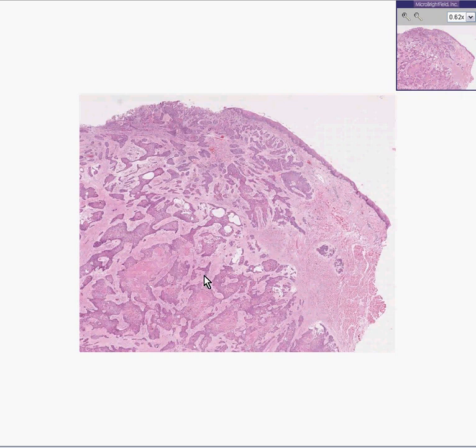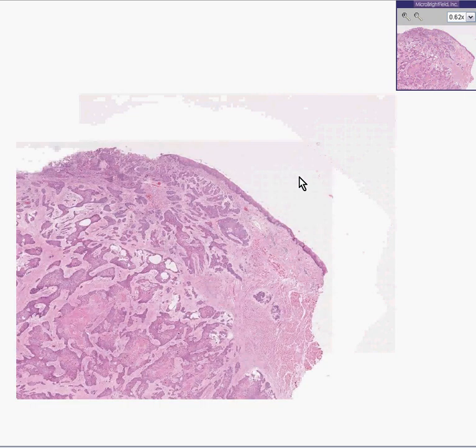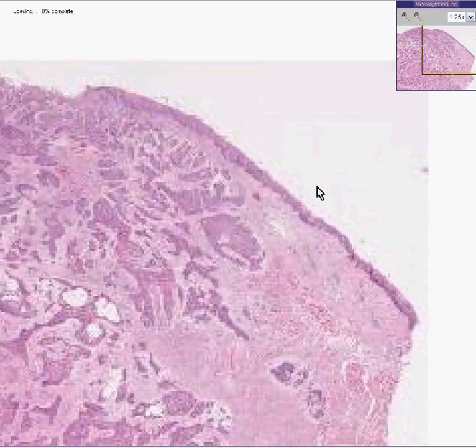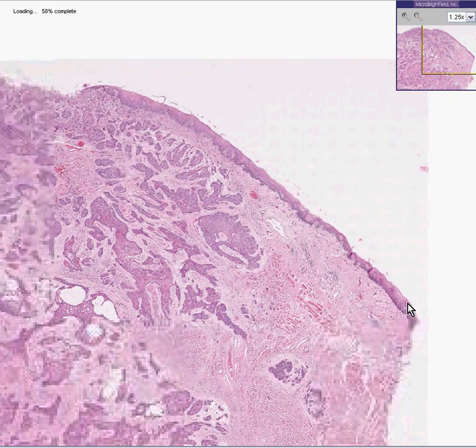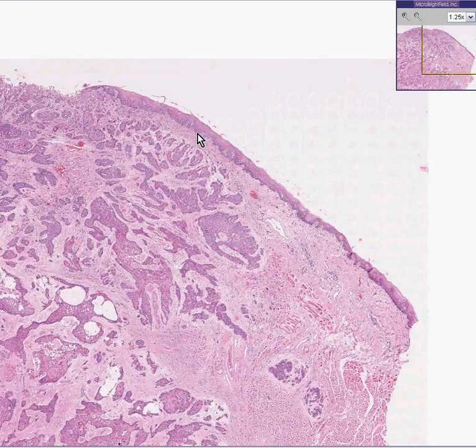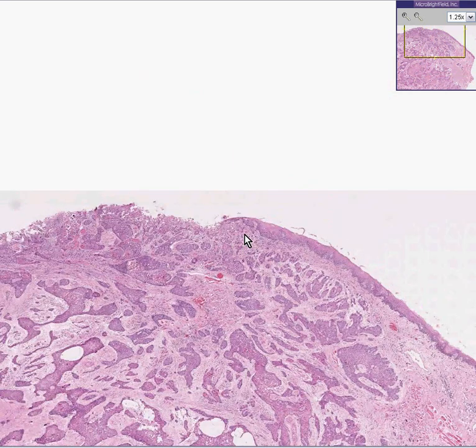Here are all the irregular blue infiltrating nests, and here's an area that was ulcerated. Here is an area, perhaps more anterior from our photograph, that is normal — a normal non-keratinized stratified squamous mucosa. Here it is extending to the ulcerated area. You can see all these tumor nests along the ulcerated area, and you can see they extend and infiltrate the underlying muscle.